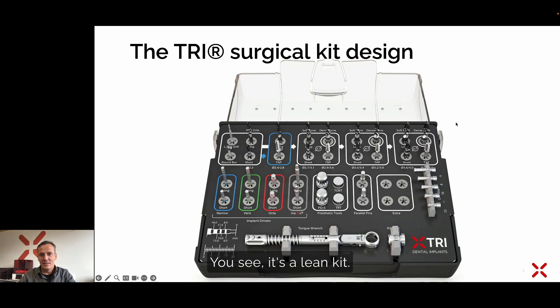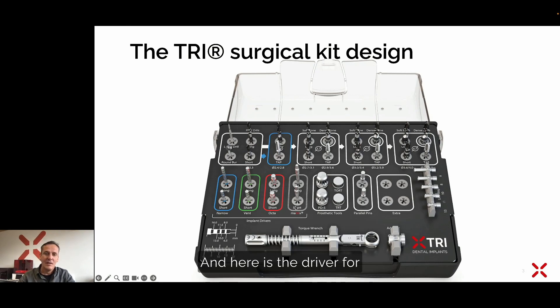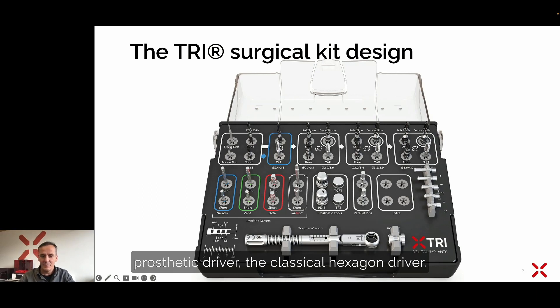You can see it's a lean kit. We always start on the top left side with the lance drill. You can see here the lance drill with its black mark at seven millimeter depth. Then there are all the following drills with different diameters, available for the different diameters of implant. Here are the drivers for the performance line — the blue, green, and red ones — and here is the driver for the matrix implants, followed by the prosthetic driver, the classical hexagon driver for all prosthetic screws.